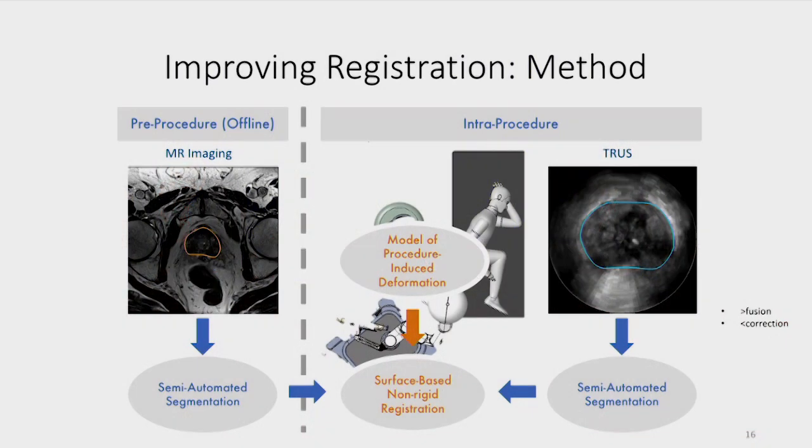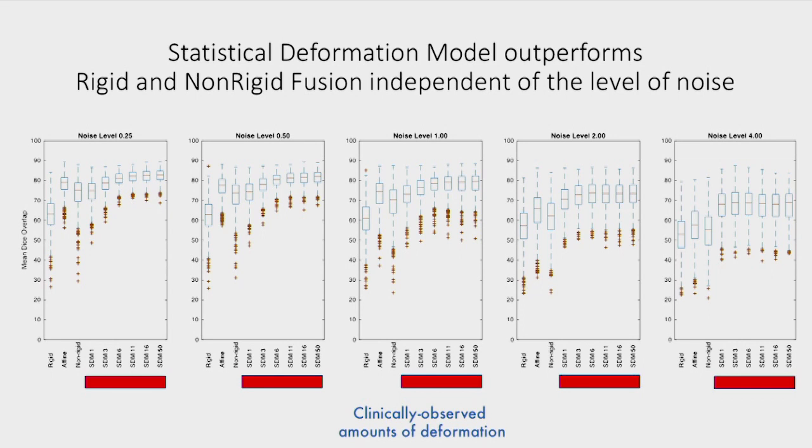I also do transperineal biopsies with fusion as well. I use the deflection to sometimes get around that little area where the puborectalis muscle pulls up the rectum, so you don't go through the rectum doing transperineal. So I don't mind the deflection as long as you watch it happen, and it depends on the amount of deformation and the type of unit you use. I don't have a problem with it.